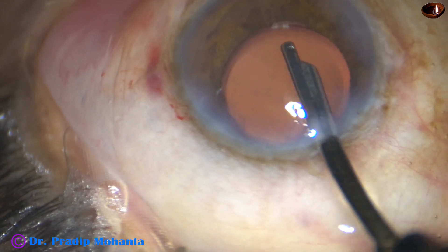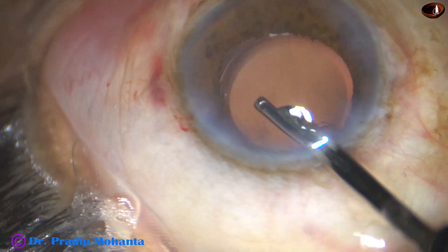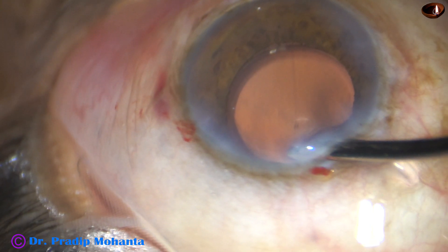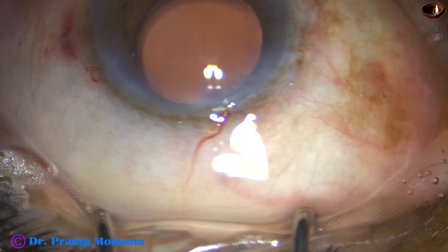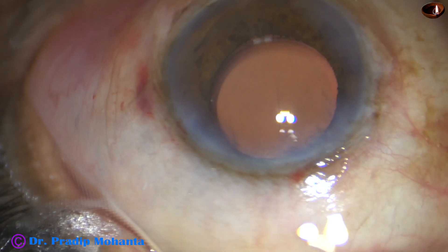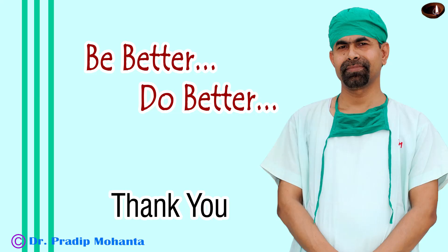This is the final lavage, and after this we are going to form the anterior chamber very nicely and conclude the case. Friends, we have to improve our skills every day and must give 100% of our expertise to each patient — they deserve it. They have put their 100% faith in us. Thank you very much for your attention. Hope this video will help you in developing your surgical skills. Be a great surgeon and serve your patients with love, respect, empathy, and great surgical competence.